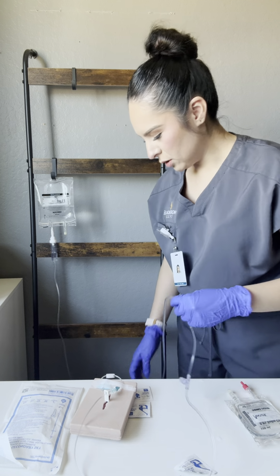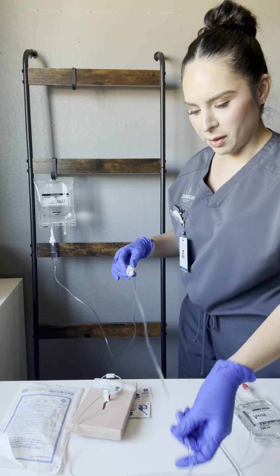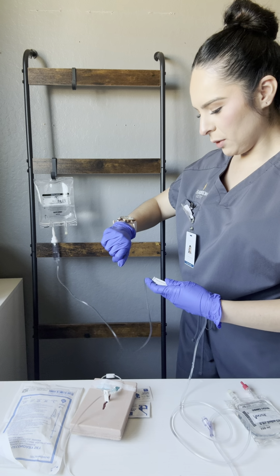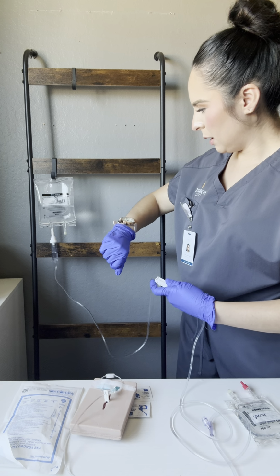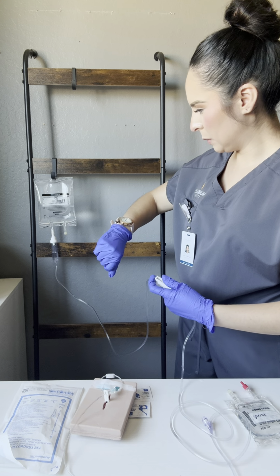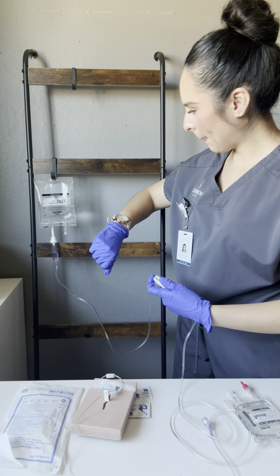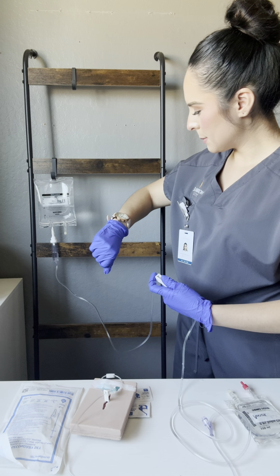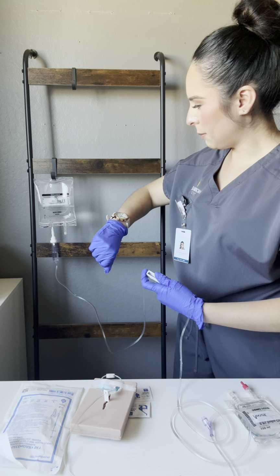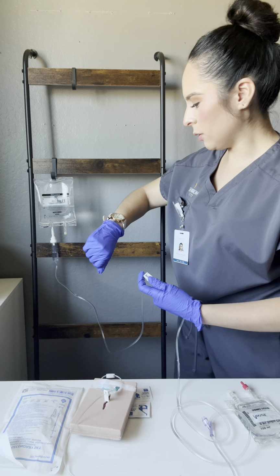And then now I'm going to adjust my flow rate of fluid. So we want 38 drops per minute. So I am going to slowly roll up the roller clamp and then time the drops for 1 full minute. And we want to make sure that we are at 38 drops per minute. We can roll up on the roller clamp to make the drops come out faster, or if they're coming out too fast, we'll want to roll down on the roller clamp.